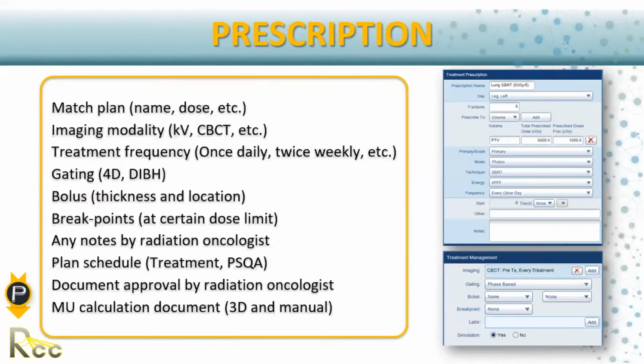The treatment details must also be specified, including the type of radiation, energy, delivery method, 3D, IMRT, VMAT, etc., and delivery schedule, weekdays, every other day, and so on. The image guidance for setup verification imaging should be specified in the prescription, with image guidance requirements and techniques at times specified by the clinical protocols or selected based on the size of the setup margins.